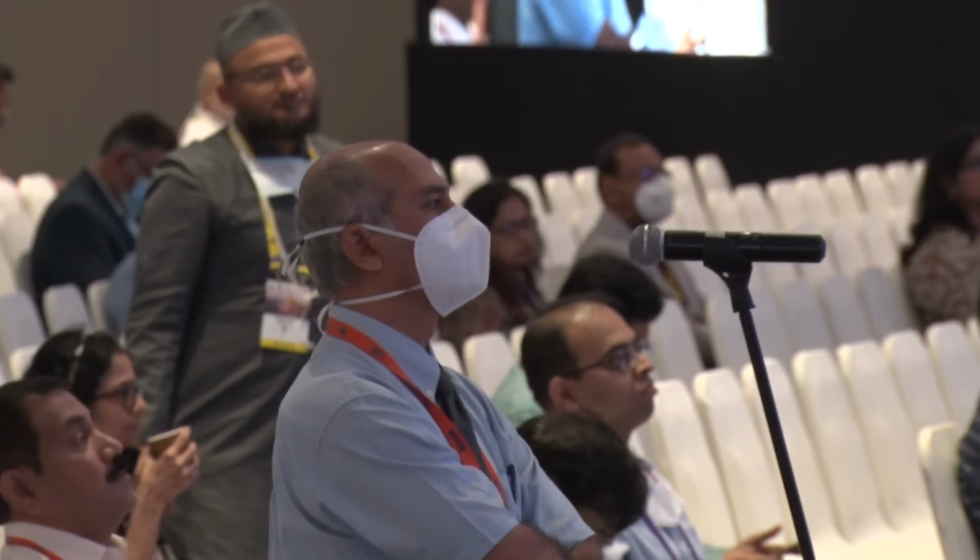I am pursuing that angle very vigorously. Those changes you see in a lot more entities, but we still do not know the interpretation, like how do we manage? For me, if I see dark spots for VKH, I know I have to treat it as VKH. If I see anastomosis, I do not know what to do. It just indicates that there has been a pressure on the choroid and you have to look for it, but it does not help in management because there are a myriad of diseases which produce that.